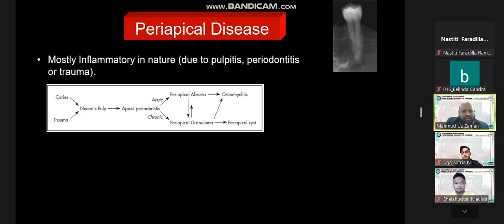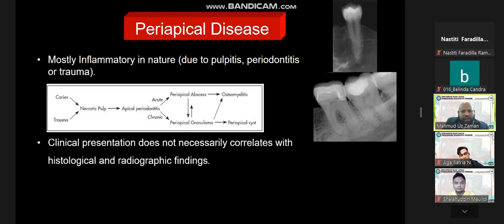So depending upon the size and shape of the disease, you will determine, but you cannot see with the naked eye, so it's better to have a periapical radiograph first. Then if needed, you'll go for panoramic radiograph.